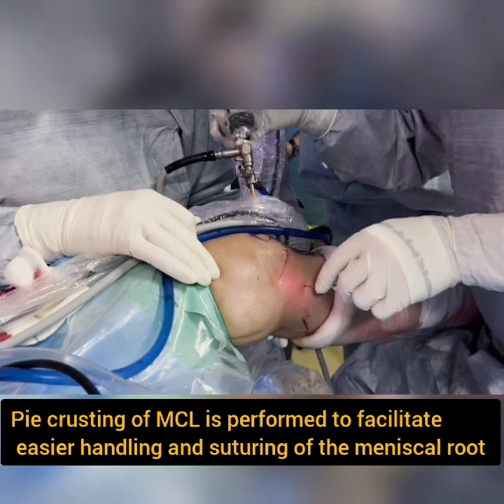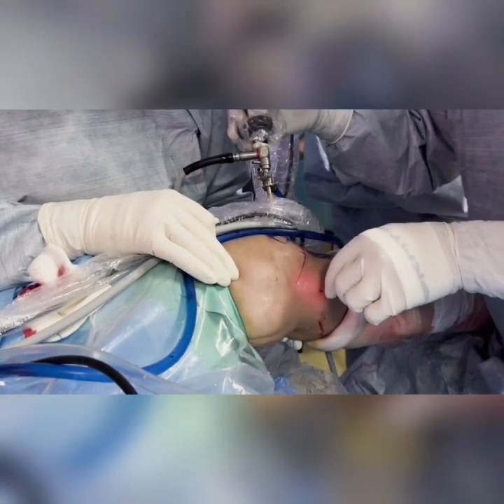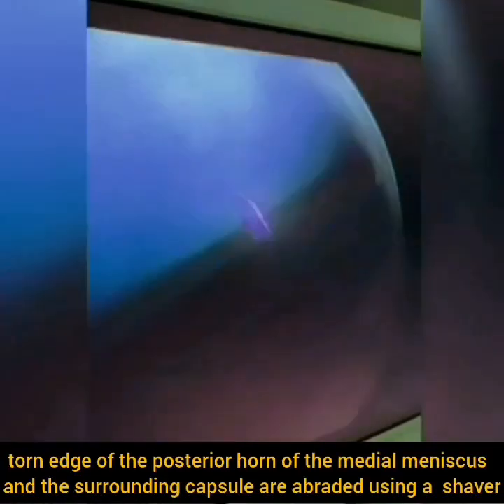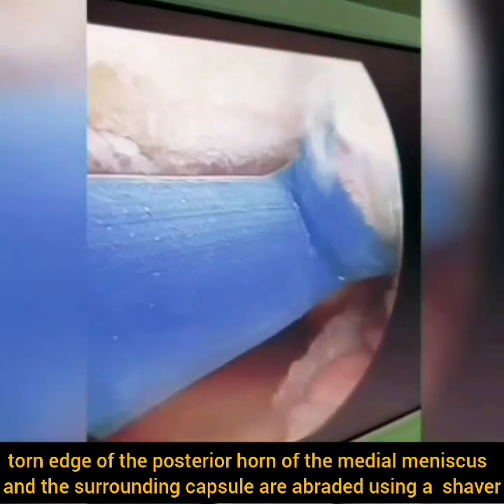Pie-crusting of the medial collateral ligament is performed to facilitate easier handling and suturing of the meniscal root during subsequent repair. The torn edge of the posterior horn of the medial meniscus and the surrounding capsule are abraded using a motorized shaver.